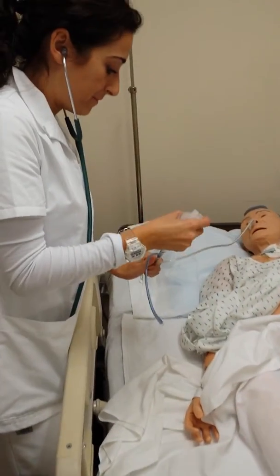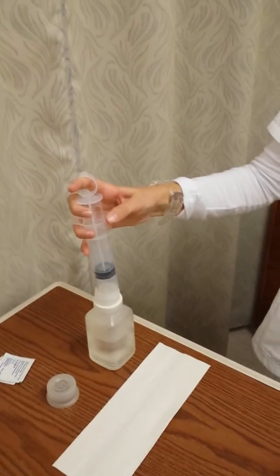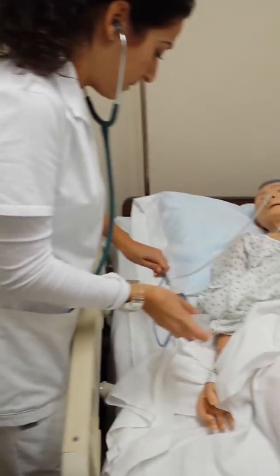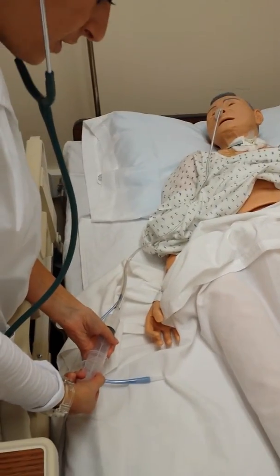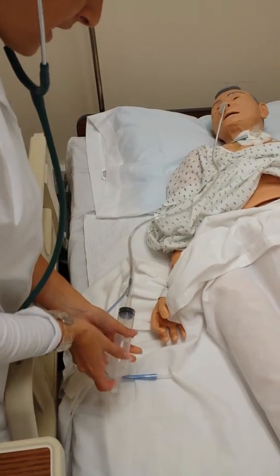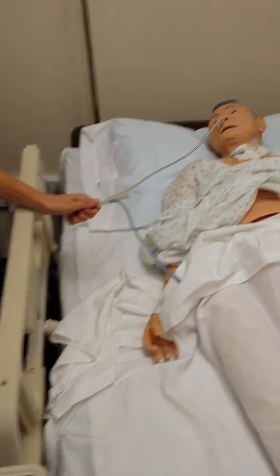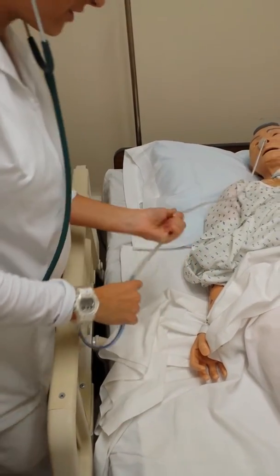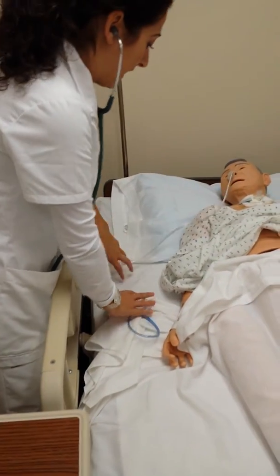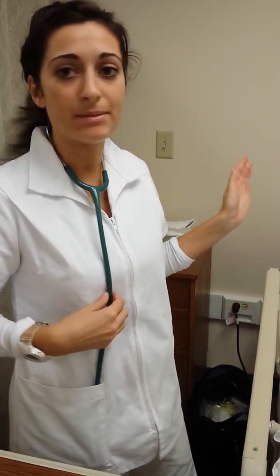Then we're going to clamp it, pull it out, and we're going to get 20 to 30 cc's of saline. We put that back in and push it through slowly, flushing the water for the irrigation. Keep the tube up on the table. Once we finish irrigating, you can put the suction back on — whatever needs to be done for that.